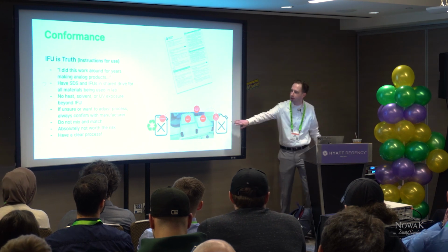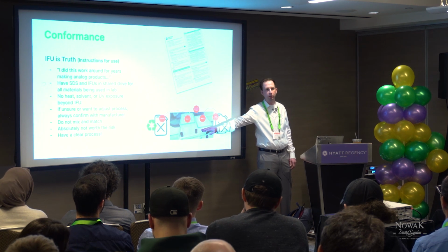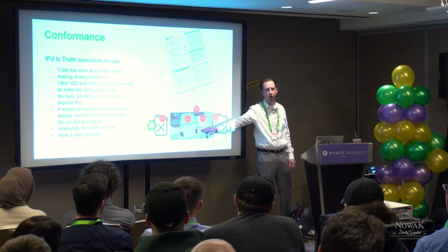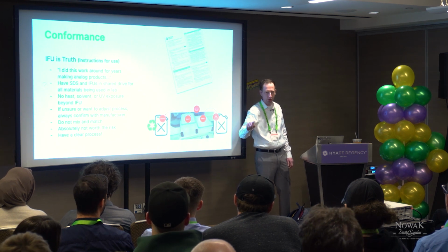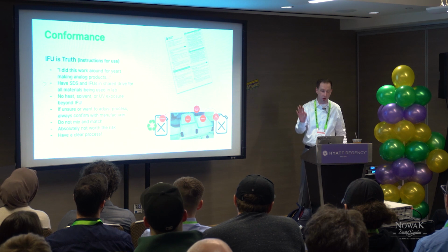But even this, the IFU could call out using an ultrasonic. We had to email and write to the company and ask, can we use an orbital wash? And what would be the equivalent two-minute cycle in an ultrasonic? And they came back and said, yes, that's okay. This is how long you should be doing it, but no more. So if you're changing even this, make sure you get it officially written. Otherwise, you could be making unsafe products, and it's not worth the risk.